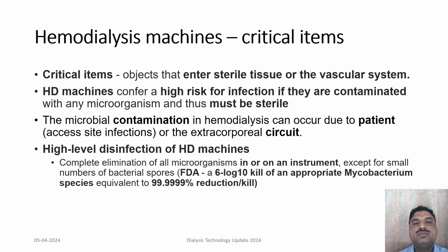So what do we mean by high level of disinfection? That means there must be a complete elimination of all microorganisms in and on the instrument except for a small number of bacterial spores. As per the FDA guidelines, appropriate high level disinfection includes a 6 log 10 kill of mycobacterium species, which is equivalent to almost a 99.9999% reduction in kill of the microbes.